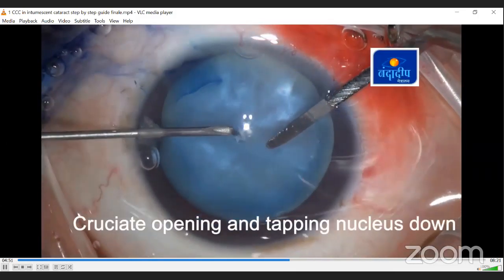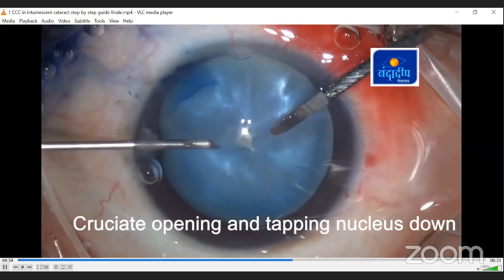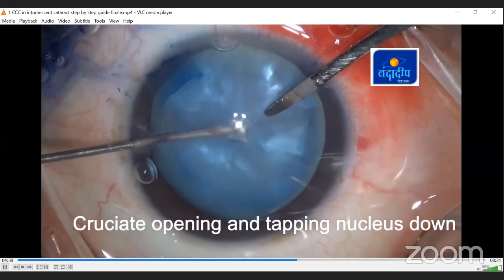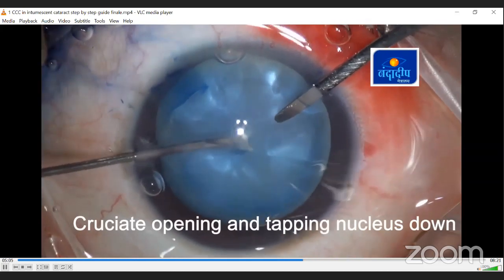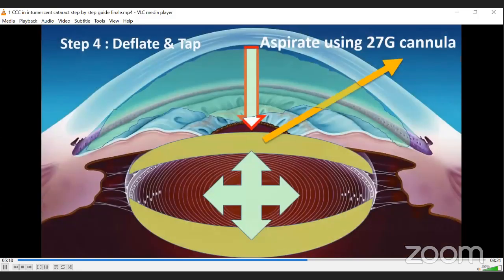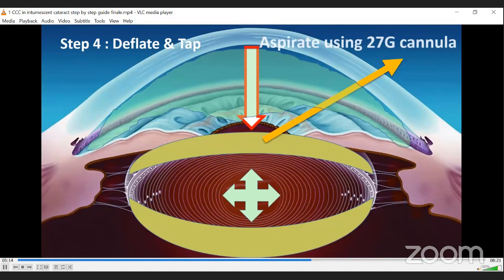So this is the cruciate incision. Just see that the anterior chamber is completely closed because I'm using the side port. Second, the anterior chamber pressure is good because I have used the soft shell technique. And what I'm doing here is that after making the anterior cruciate incision, I tapped the nucleus down a little bit so that the fluid which is behind the lens nucleus also starts dispersing anteriorly.